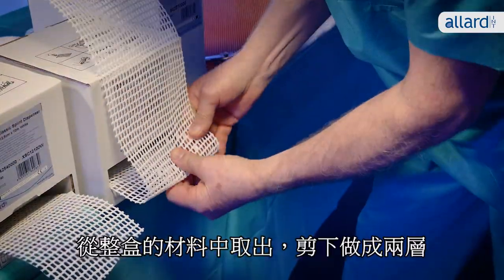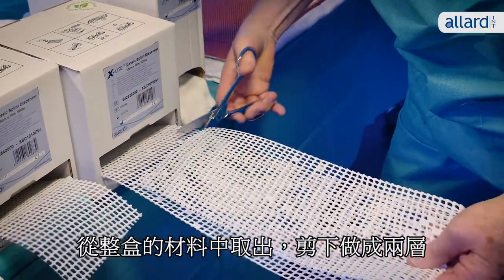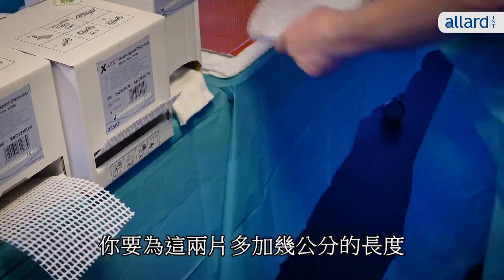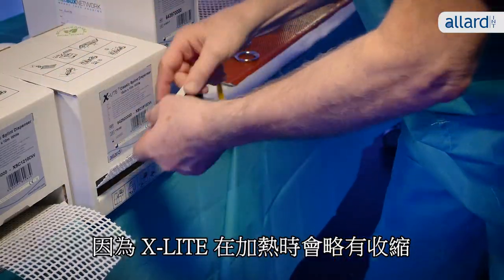Draw the material from the dispenser box, cutting them to create double layers. You might want to add a few centimeters to both pieces since X-Lite shrinks slightly when heated.